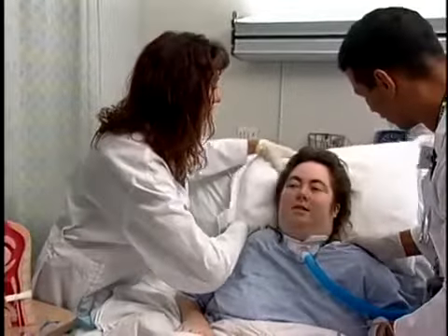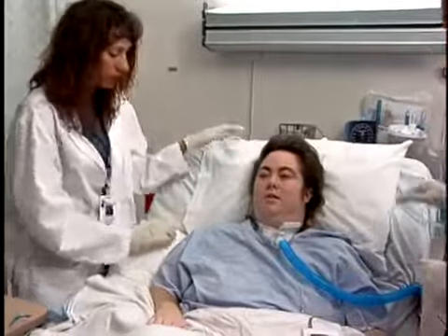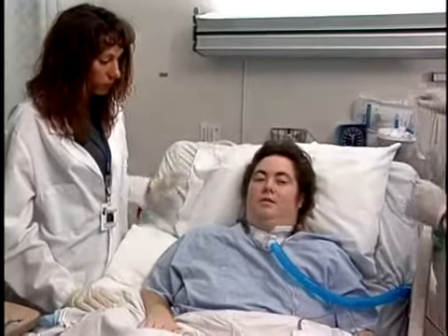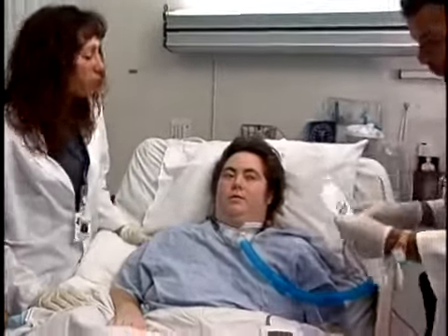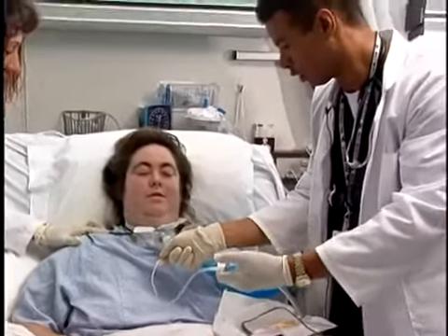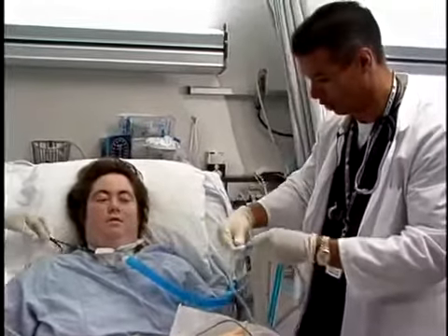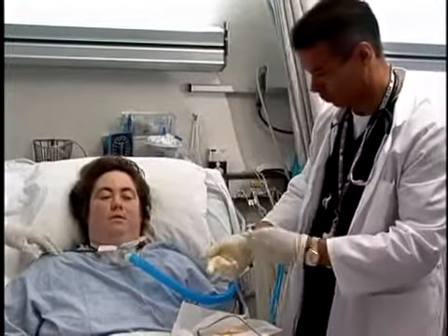Position your patient to ensure optimal airway patency. If your patient is slouched or the ventilator tubing is pulling on the airway, it may cause airway obstruction. When the cuff is deflated, secretions in the upper airway may move towards the lower airway, causing obstruction of airflow. Therefore, the patient may require repeated suctioning.